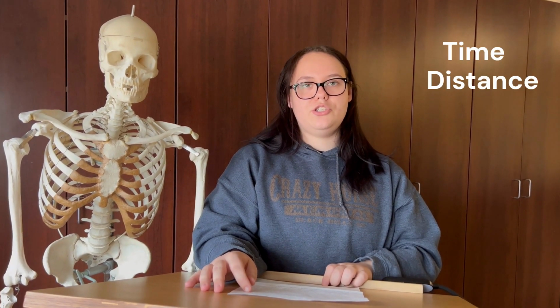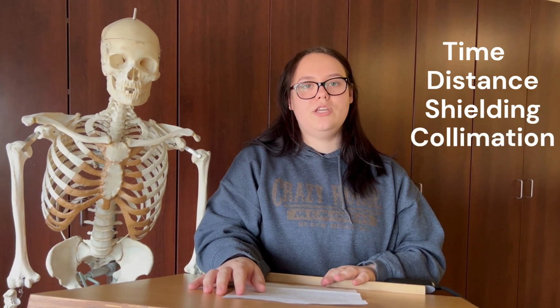In this video, we discuss the importance of following ALARA principles to reduce unnecessary and potentially harmful exposure to both the patients and medical personnel. We demonstrated some key ALARA principles such as time, distance, shielding, and the importance of proper collimation. It is important to ensure that you are using proper collimation to decrease the exposure of your patients, as well as improve image quality and reduce the need of repeat exposures.